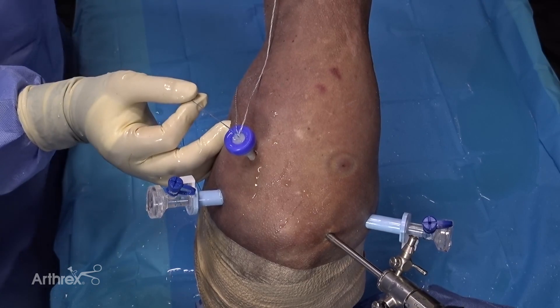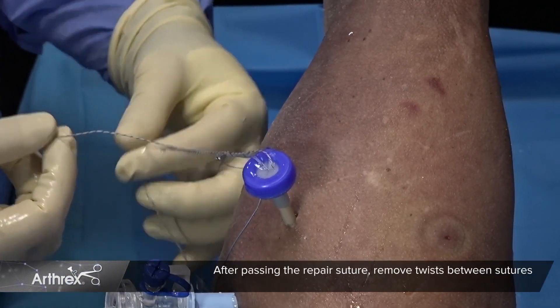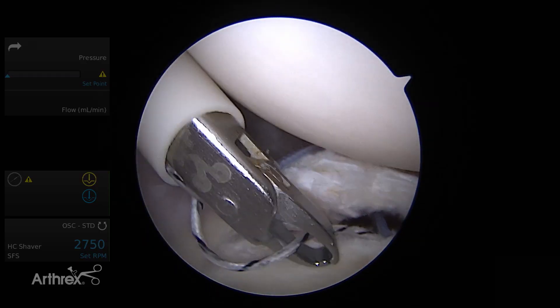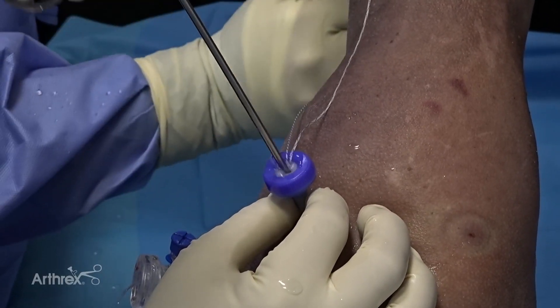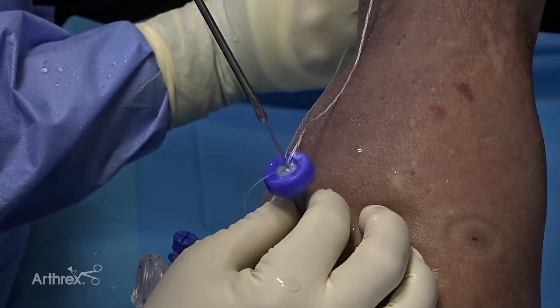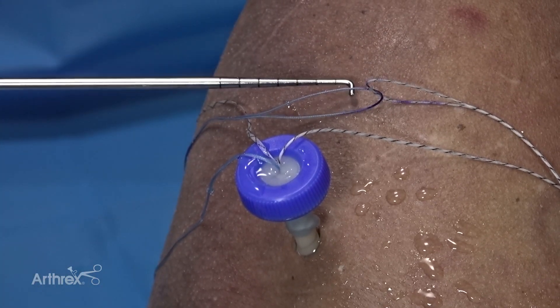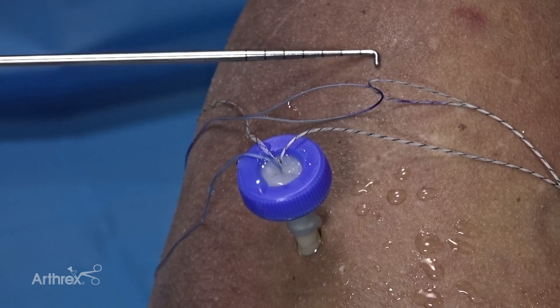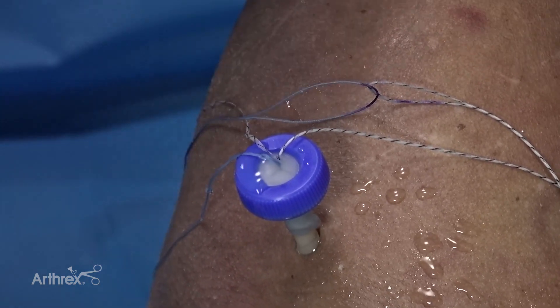Once the repair stitch has been passed through the labrum, we're ready to shuttle the repair stitch through the anchor. It's in your best interest to remove all the tangles from the repair suture to allow optimal shuttling. To do this, I'd recommend grabbing each suture individually with a ring grasper and slowly pulling them out of the cannula before shuttling. You can appreciate the purple mark on the repair stitch, which indicates how much of the repair stitch needs to be placed through the loop of the shuttle link.